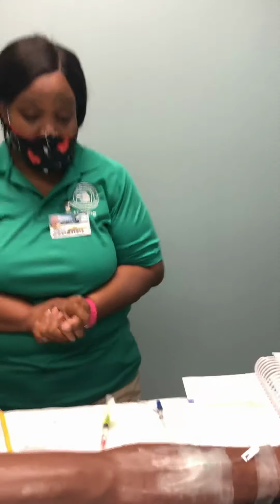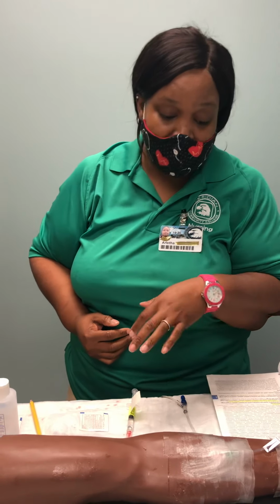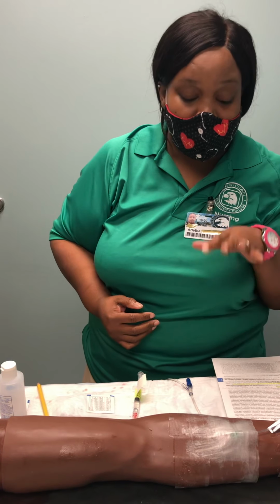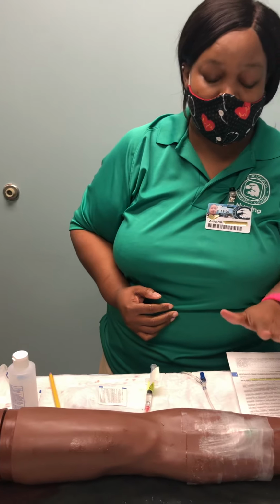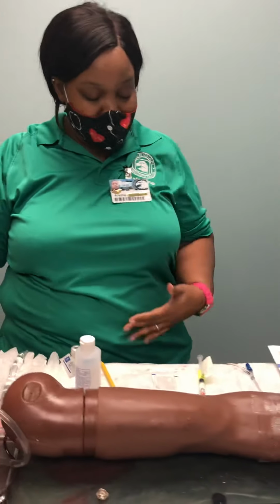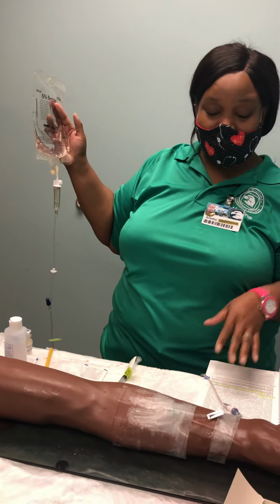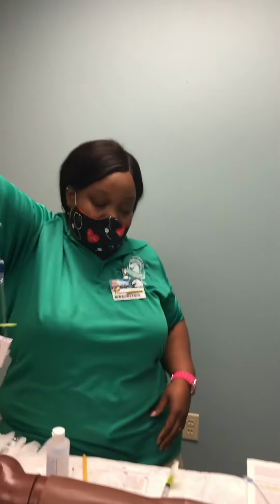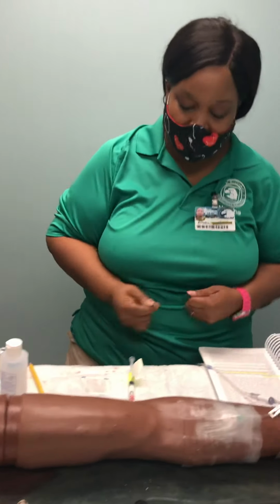Okay, and after I do that, I am going to check my IV site. I'm checking for any redness, swelling, leakage, any sign of infiltration. I am going to lower the primary fluid to see good blood return. And once I lower it to see good blood return, they let me know that the IV is good, patent. So after I do that, it's time to give my medication.